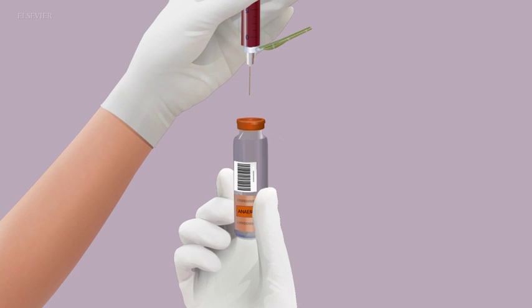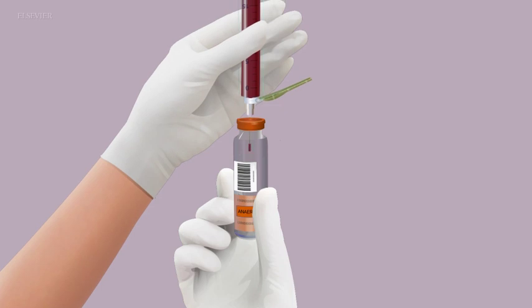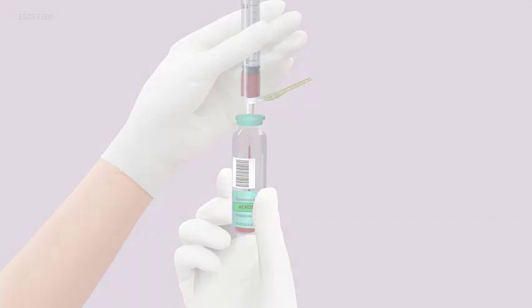Transfer the specimen to the culture bottles. Distribute the blood volume evenly between the culture bottles without replacing the needle. If both anaerobic and aerobic samples are needed, fill the anaerobic culture bottle first. Keep the bottle and syringe upright and inoculate the anaerobic bottle, ensuring that no air is transferred from the syringe into the anaerobic bottle. Inoculate the aerobic culture bottle with a minimum of 10 milliliters for the most accurate results.